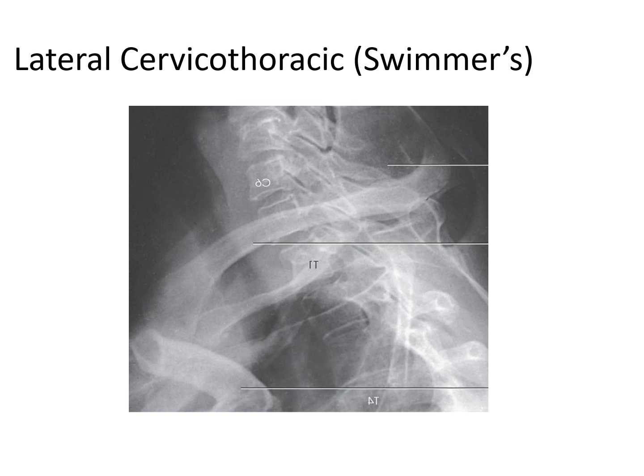Yeah, that's it. See that clavicle running right through? Now look, it runs right through the body of C7. Can we tell if C7 is fractured? Not on this one we can't. The elevated clavicle runs right through it.